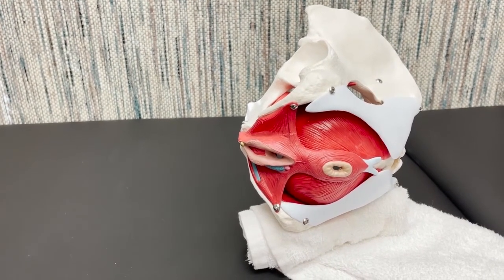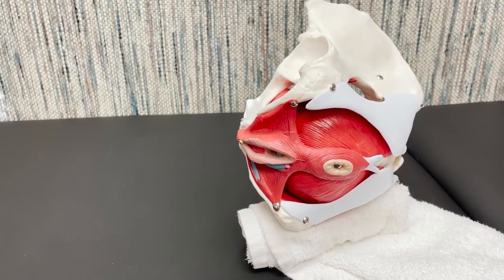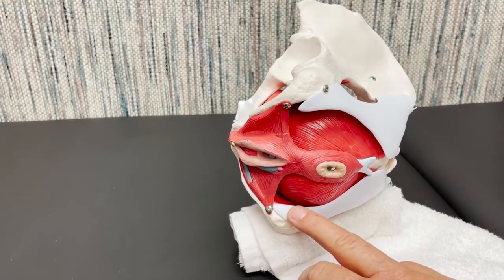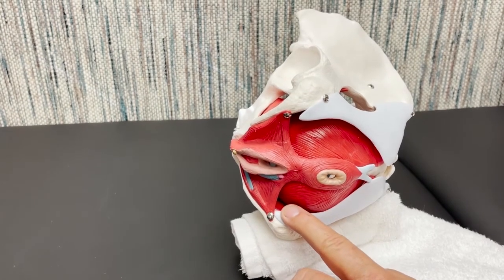Again, going to be in the sideline position. Treatment leg is going to be mat side. Top side leg is just flexed at the hip and the knee. We're going to palpate the medial side of the ischial tuberosity, again, adjacent to the perineal body. So perineal body, ischial tuberosity here.